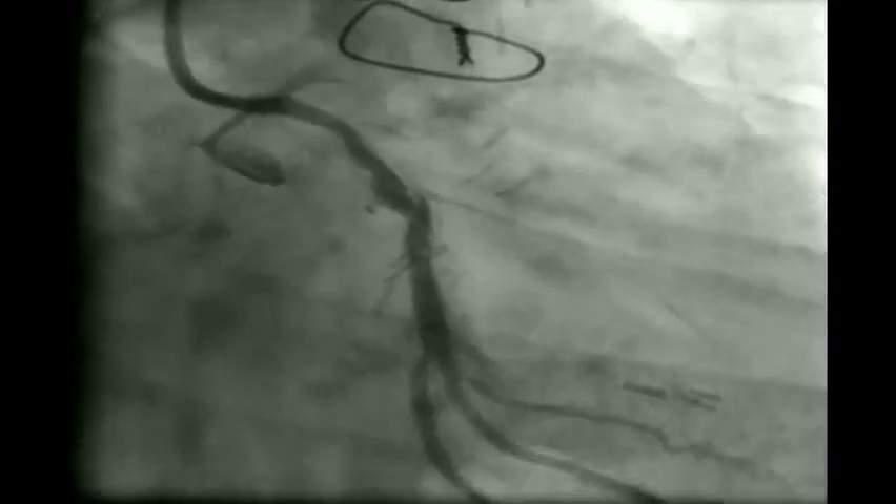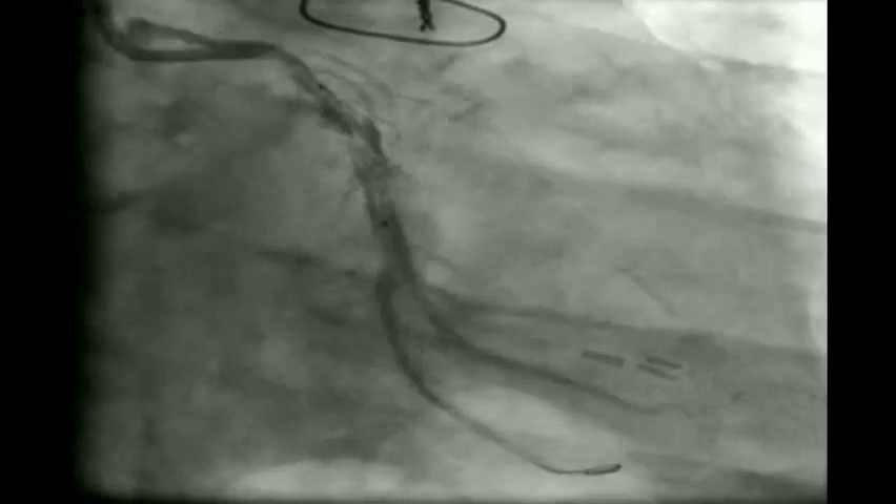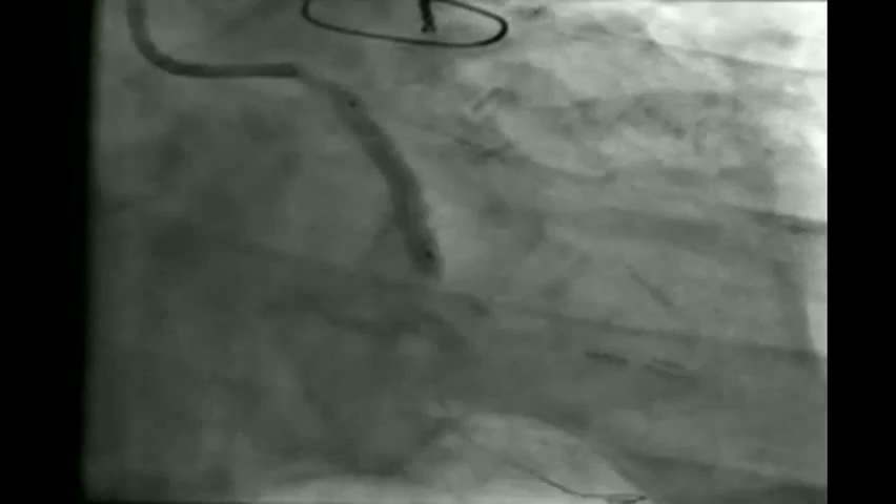As you can see, there is a dissection which is now being covered by the absorb stent. We placed a 3.5 x 28 mm absorb stent covering the distal 3 lesions, deployed at 16 atm — the maximum atmosphere for this absorb stent. The result is acceptable: residual stenosis is less than 10%, and we do not proceed with post-stent dilatation. Deployment took approximately 60 seconds.